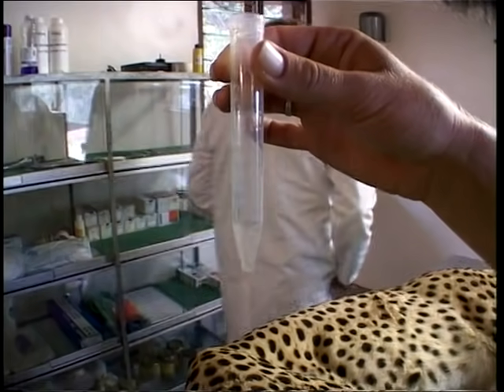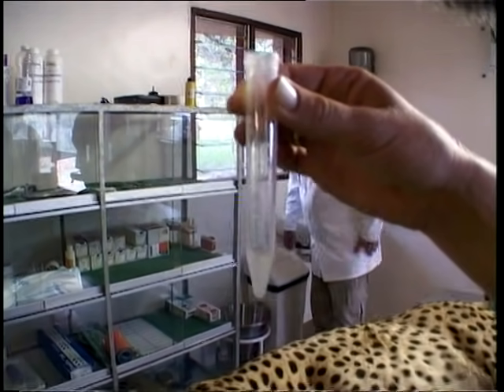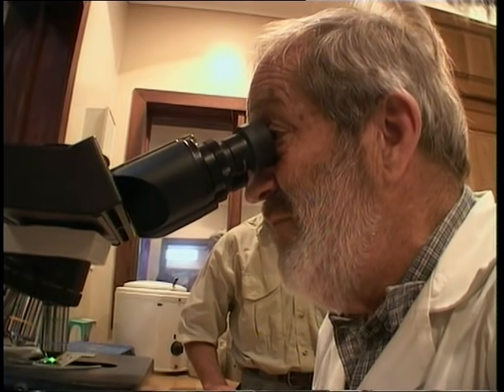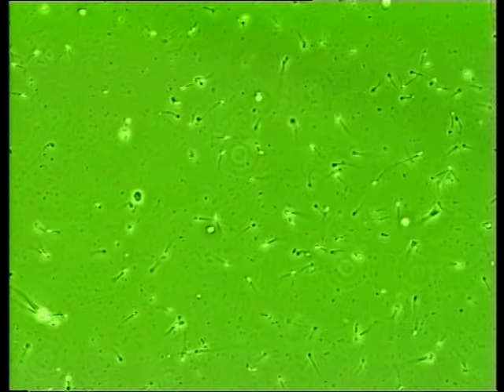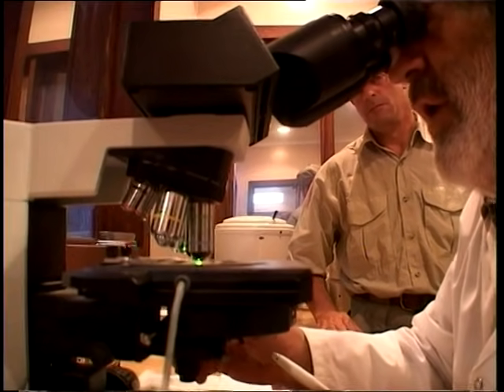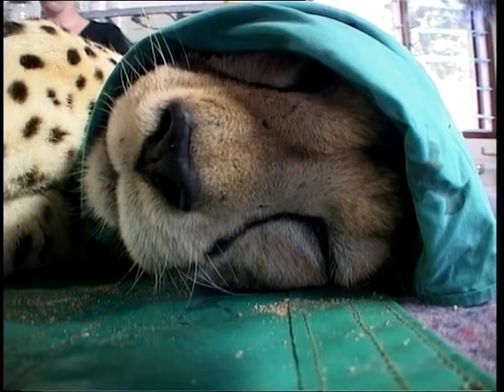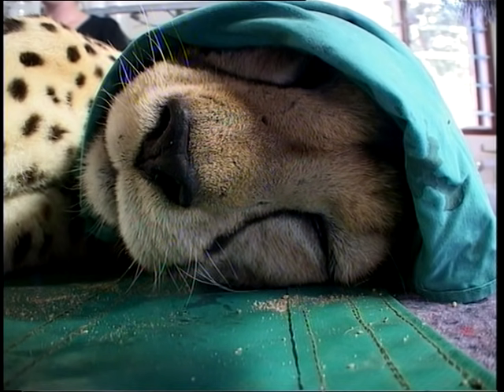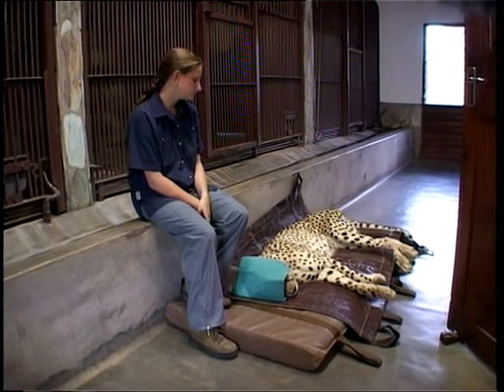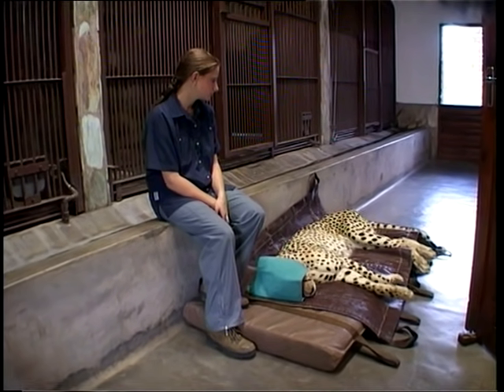It's a very pale specimen in comparison to a dog or a cat semen sample. It's not very dense. There's approximately 8 million spermatozoa per milliliter. We look at the liveliness of the spermatozoa, whether they are swimming and if they're swimming in a straight direction. And on that basis, we decide whether it's a good or bad sample. In this case, his semen is not wonderful, but we would classify it as being fair. The second guy has virtually no sperm at all, and so he would not be included in the breeding program.